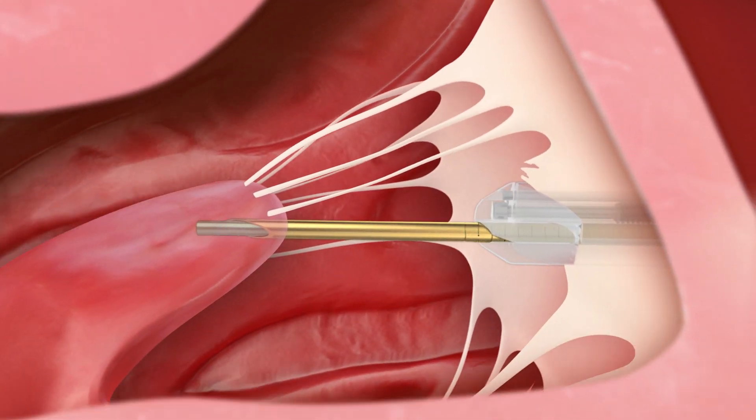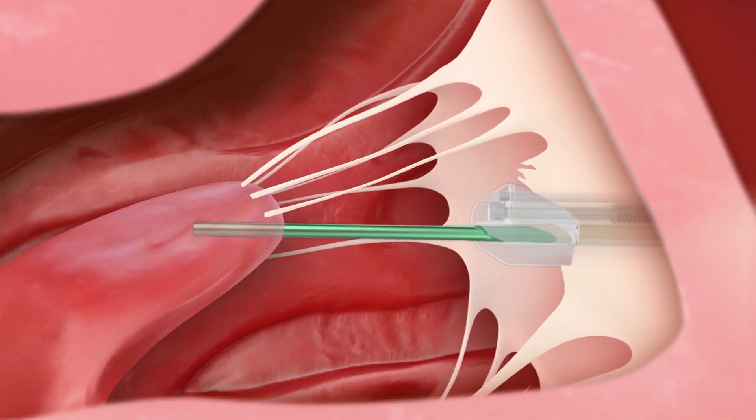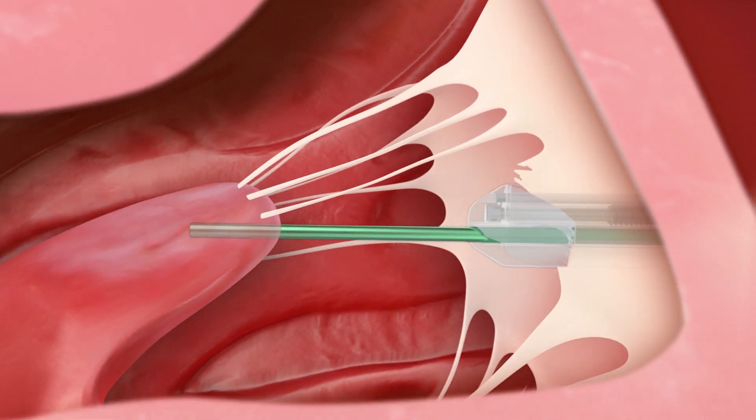The needle is then completely retracted. The sleeve is also retracted, allowing the distal anchor to be released inside the papillary muscle.